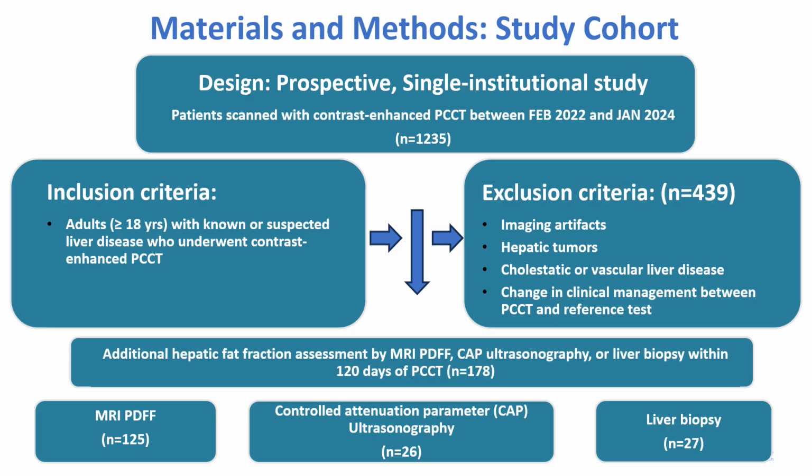So in total, 178 patients were included. All had PCCT and one of the three reference standards, which is 125 patients had MRI, 26 patients had ultrasound, and 27 patients had liver biopsy in addition to the PCCT.